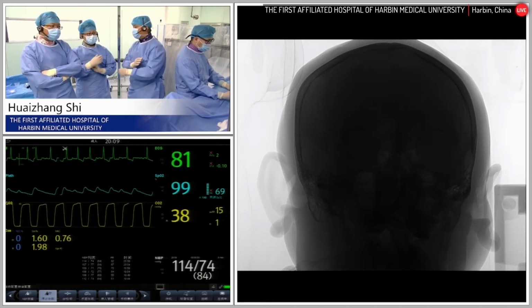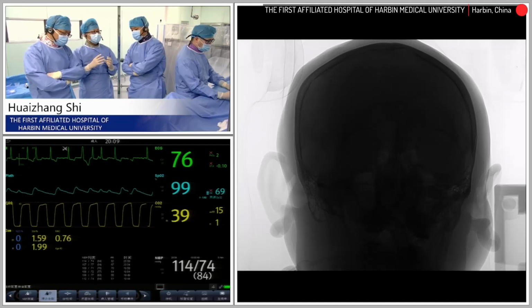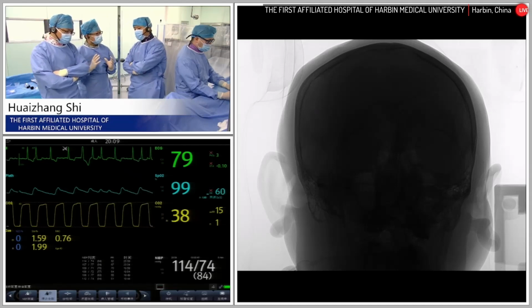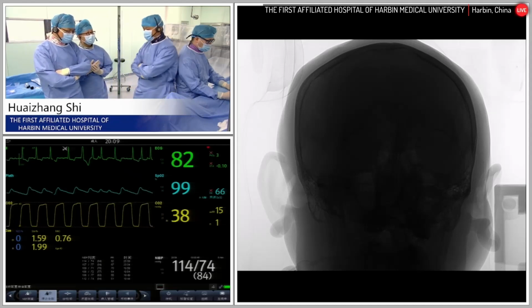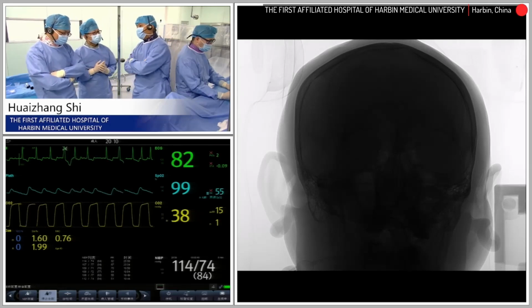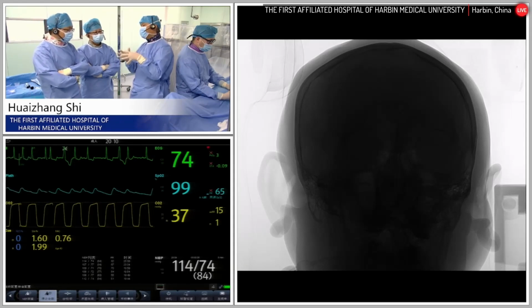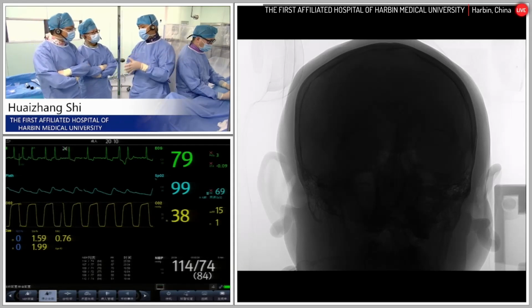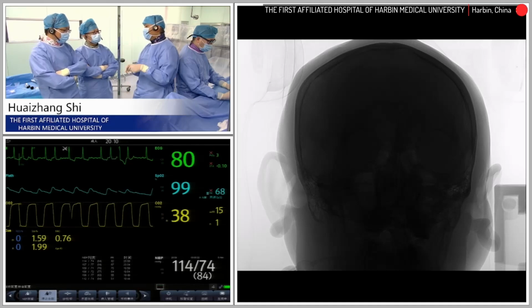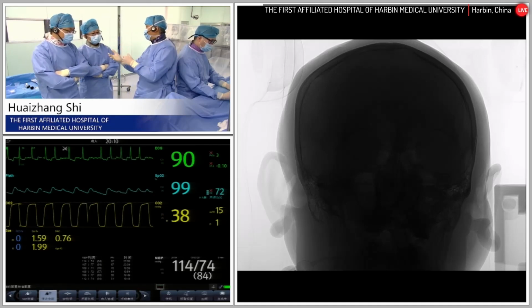Dr. Shi, do you have the confidence that this new device, the Fastunnel, will be widely used? I don't think so, actually. You don't think so? Because it's more stiff. I think for such a case it's okay, because the vessel is very straight, especially the distal part, which is very long and very straight.